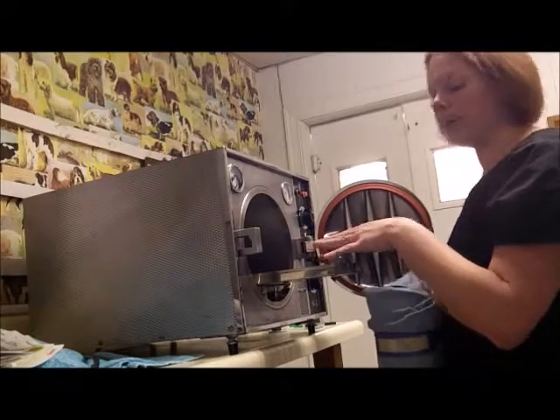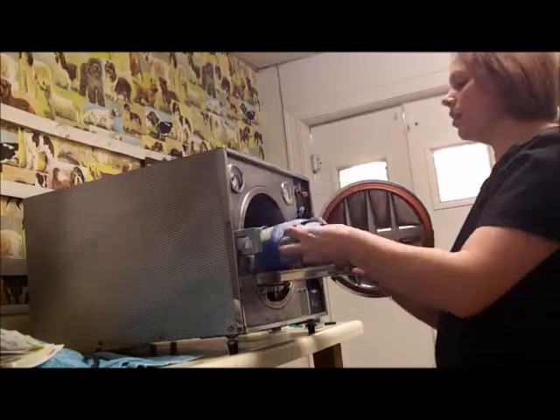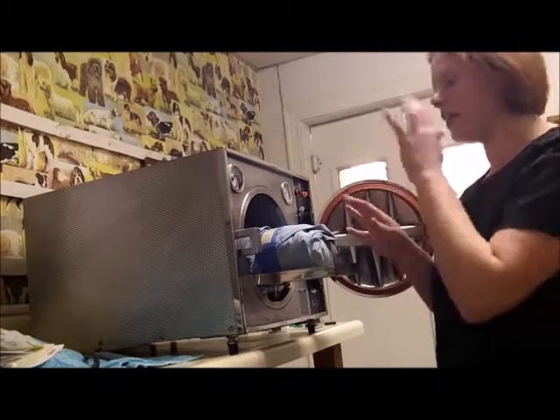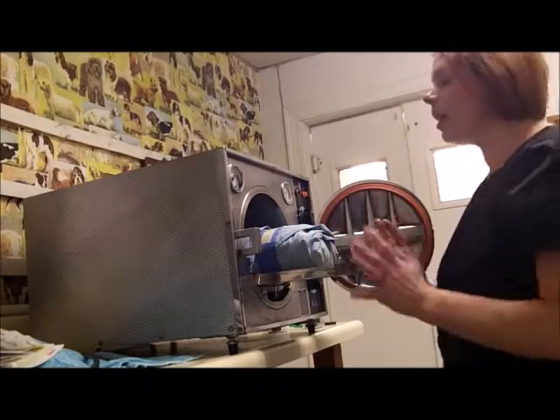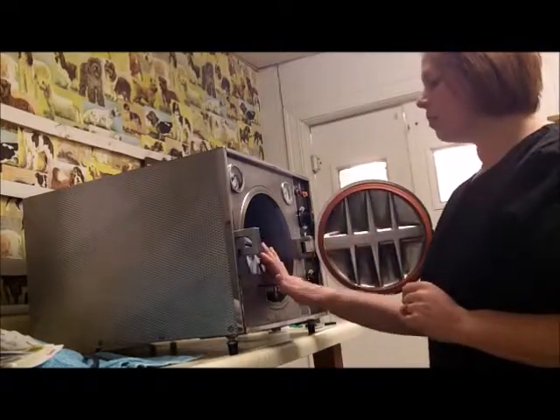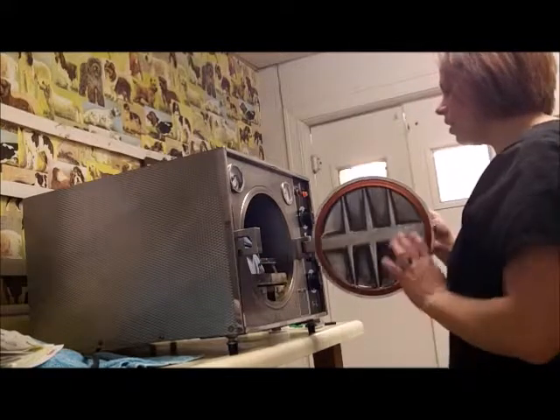We've got a single tray in here. I'm going to place the pack on the tray, making sure that it's not touching the sides or stacked on anything, or anything stacked on top of it. We want to make sure that the steam is able to reach the entire pack on all sides. Slide the tray in. This one works.